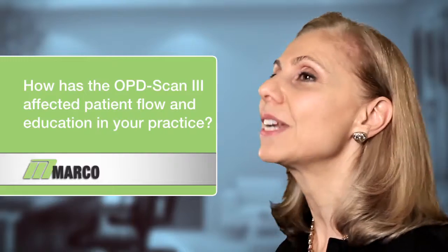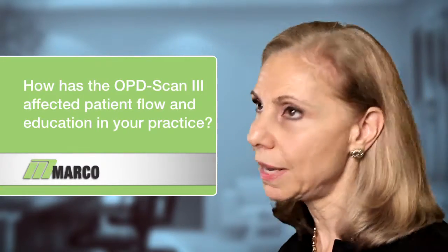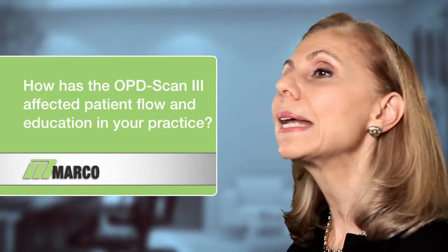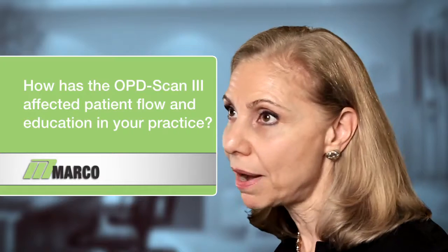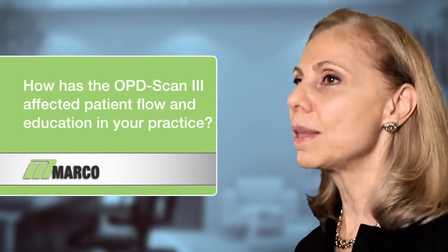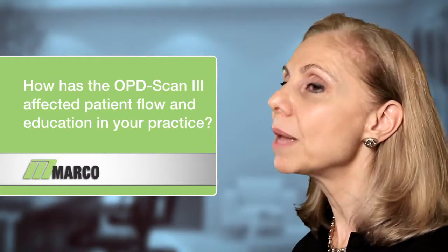Then this information is networked into our exam rooms. So when the patient is brought into the examination room, these maps are uploaded on a large screen monitor. When I come into the room, the map is there, the patient is there, and his or her family member is there. So I am able to better explain what's going on.